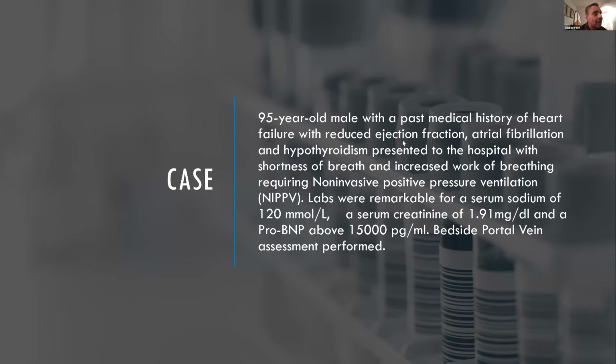When I think about a case, I'm thinking in terms of probabilities, right? And I'm ordering the tests that shift my probabilities to what my primary diagnosis is. The urine lytes are helpful, but they're not absolutely necessary. If I put a probe on and the patient has a dilated IVC and high VExUS score, I'm diuresing no matter what.